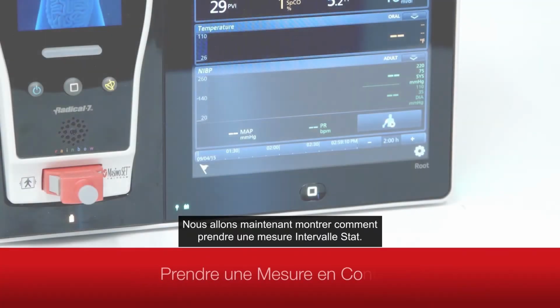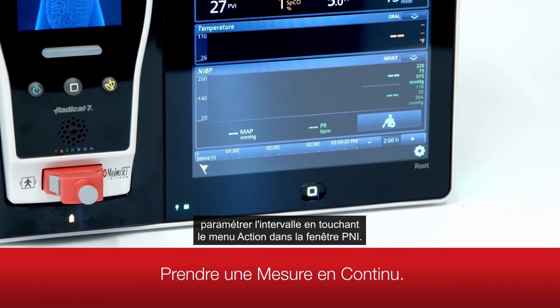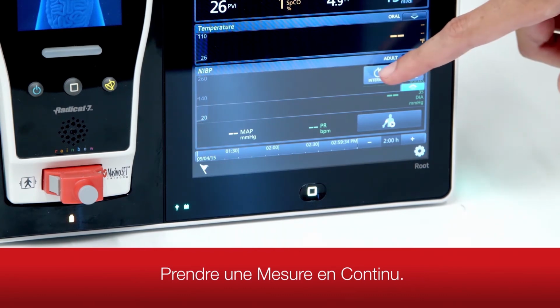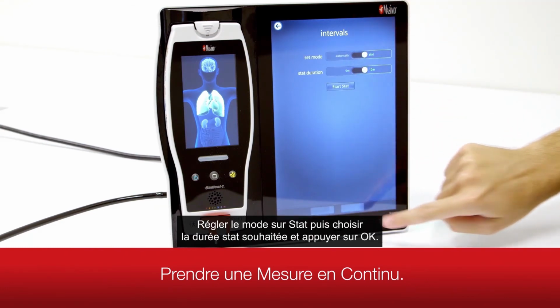We will now demonstrate how to take a stat interval measurement. Recall that the stat interval mode will take blood pressure measurements continuously for the desired duration. First, set your interval setting by touching the Action menu in the NIBP window. Select the Intervals button. Set the mode to Stat and then select the desired stat duration and touch OK.